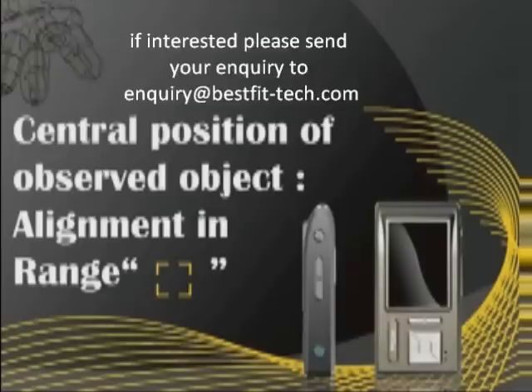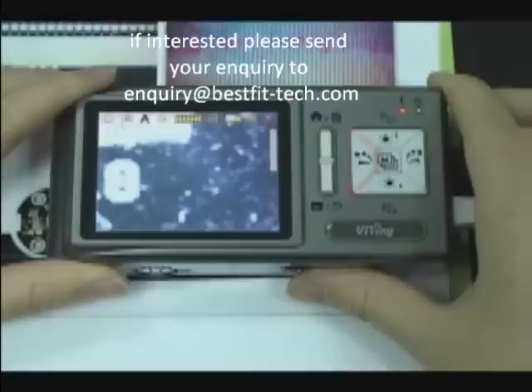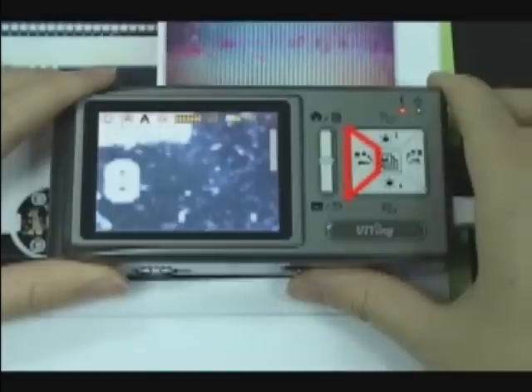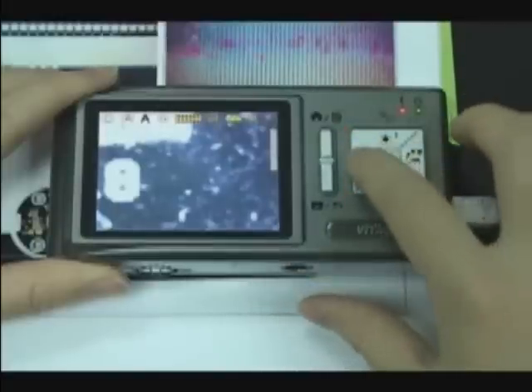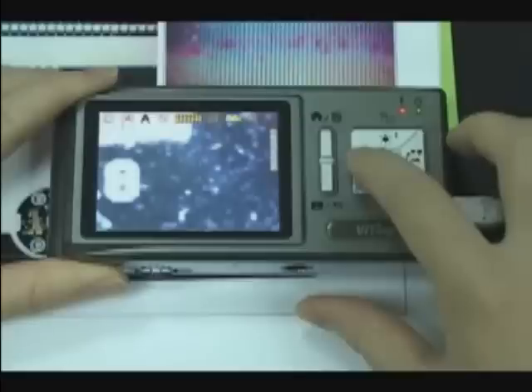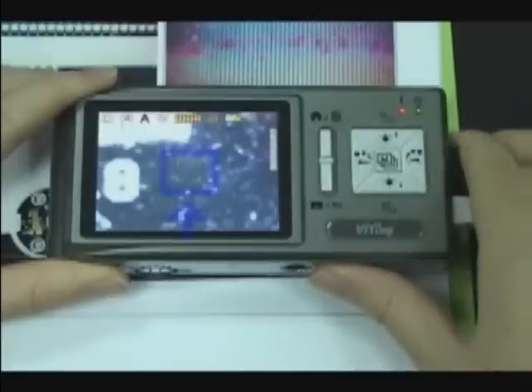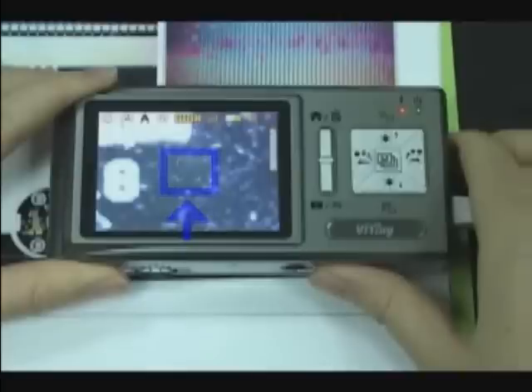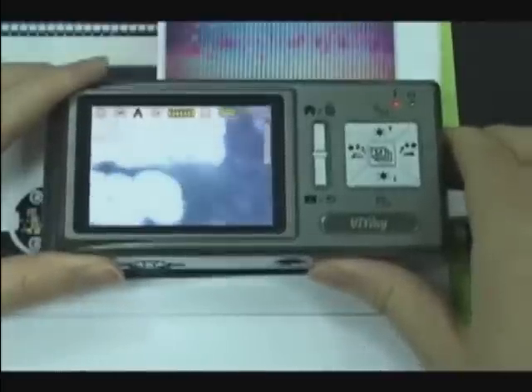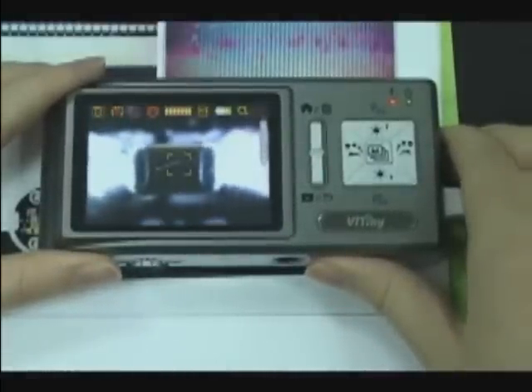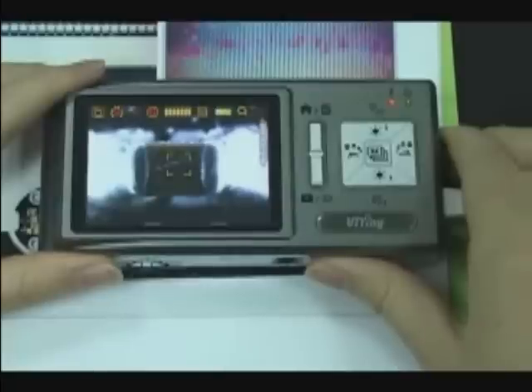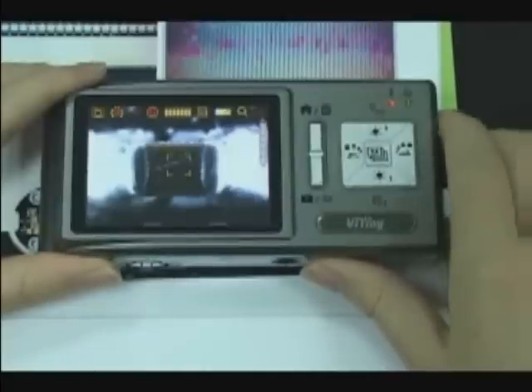Central position of observed object — alignment and range. Press the left button for a long time to display the alignment range sign. Use the sign to assist in centering the observed object. Press it again to shut down the sign.